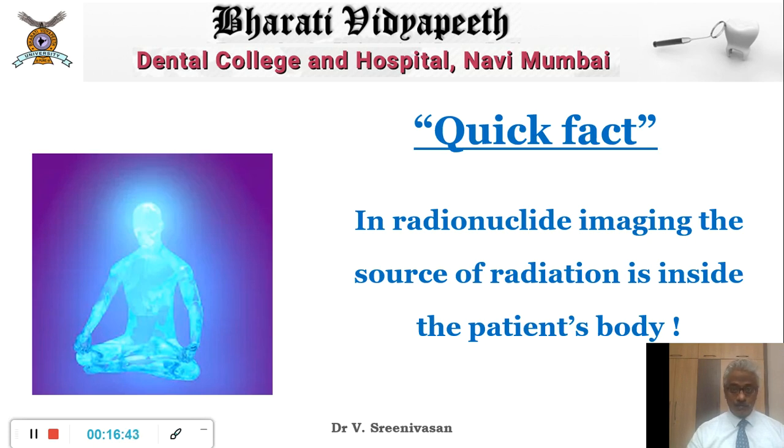That was something different and unique. And now we have a situation where the production of the radiation signal is from within the body and the receptors are outside. So the patient is actually radiating energy, and you have to isolate him for 6 to 8 hours so that he does not give a dose of radiation which is not called for to unsuspecting relatives or the public at large.